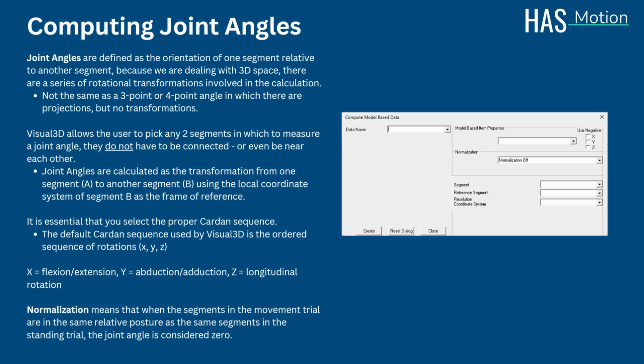One of the options for joint angles is to select normalization. This is not generally recommended, however. Normalization means that when the segments in the movement trial are in the same relative posture as the same segments in the standing trial, the joint angle is considered zero. The problem with the calculation of a normalized angle is that the standing posture and the movement trial should both be aligned with the laboratory axis. Getting a patient to stand oriented relative to the lab may not be possible in some situations. An alternative approach is to create virtual segments which define the desired angles in the standing posture.